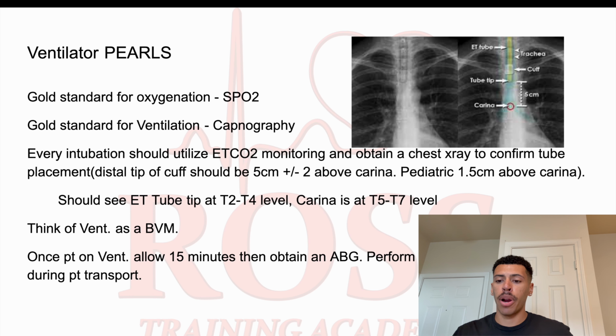So some ventilator pearls are things to keep in mind with the ventilator. The gold standard for oxygenation is going to be monitoring SpO2 levels. The gold standard for monitoring ventilation is going to be capnography, so get end tidal on the patient. Every intubation, you should be utilizing end tidal monitoring. And then it is preferred to get a chest x-ray just to confirm the placement of the tube.